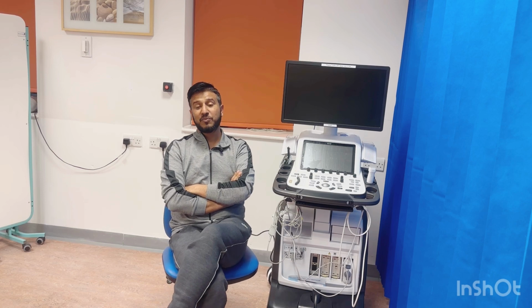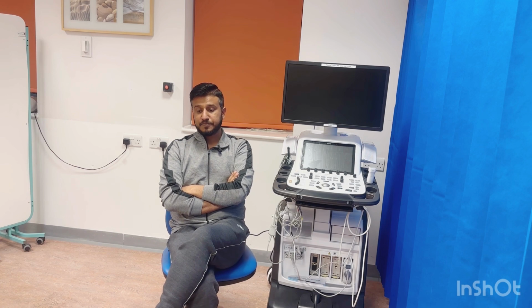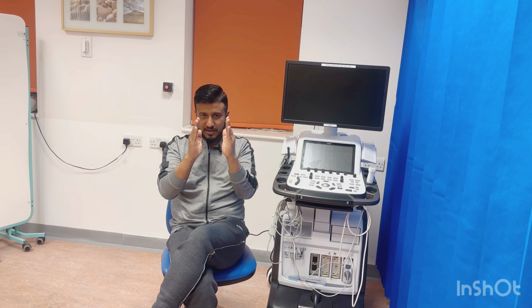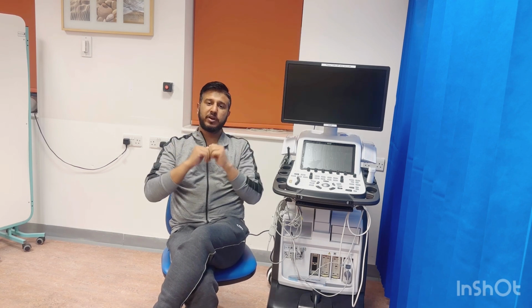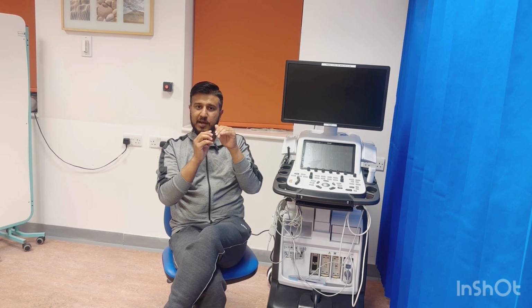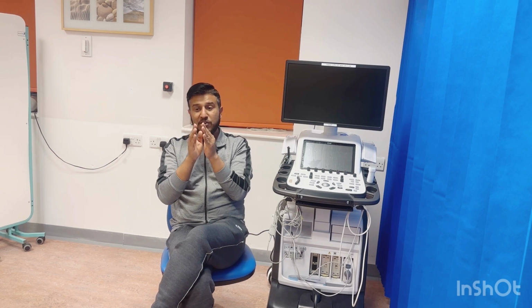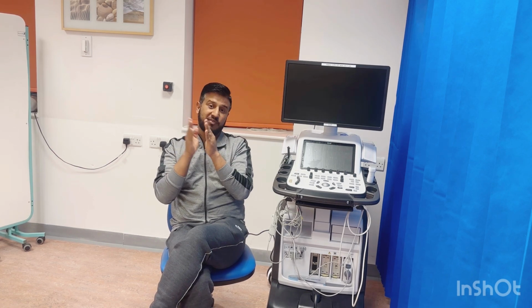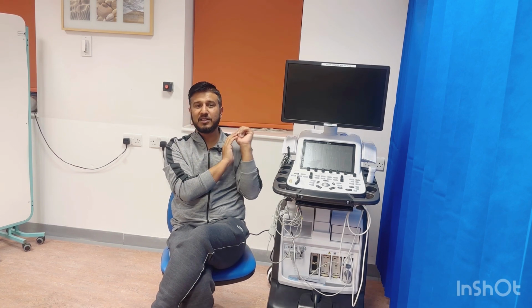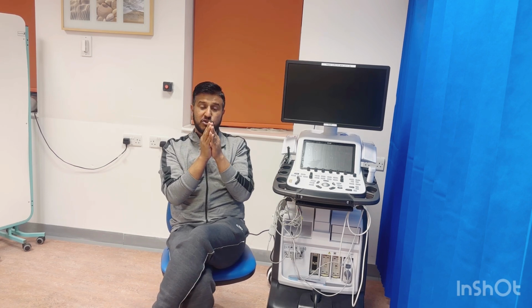Once you are going to measure the vena contracta, there are some points you need to keep in mind. One is that you need to zoom it. Zoom your image, decrease the color box just for your aortic valve, put it there, and see the jet. Whenever you are going to measure the vena contracta, make sure that you are seeing all three components of your jet. You are seeing the flow convergence, the vena contracta, and the body of the jet as well. If you are seeing these things, it means you are in a good position to measure it.